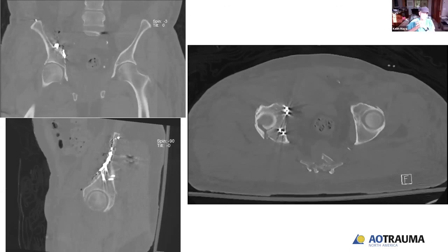On the AP, it looks like he's not retroverted as far as his native anatomy or secondarily. The thing that is bothersome is the posterior superior location. So I think everybody's had those cases that are associated with a dislocation in the same location, which look relatively innocuous, but were then treated by somebody non-operatively and led to recurrent instability, and then you've got problems.